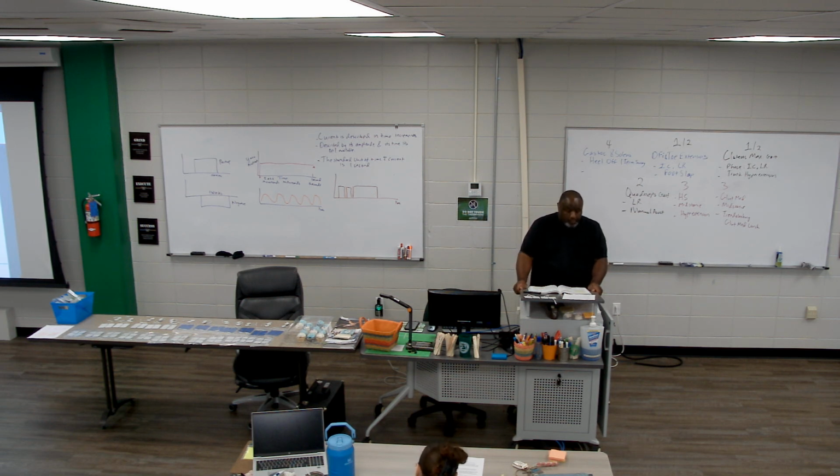The book tells us sensory fibers generally fire first. So when we're doing E-stim, the first thing we're going to start to depolarize are sensory nerve fibers. They'll let us know because we'll get sensations of tingling, prickling, and pins and needles. So that's how you know you've depolarized a sensory nerve. Sensory fibers are smaller than other fibers, but they're so close to the surface, they're easily stimulated.